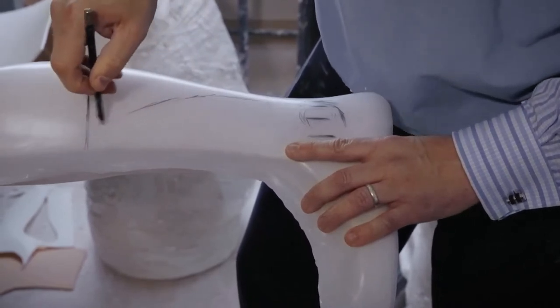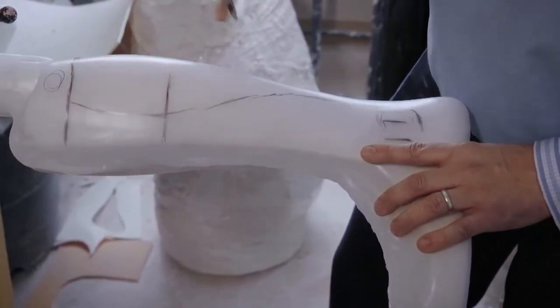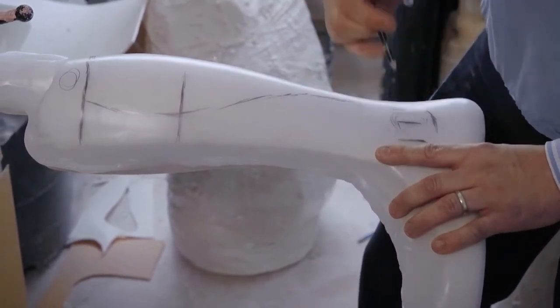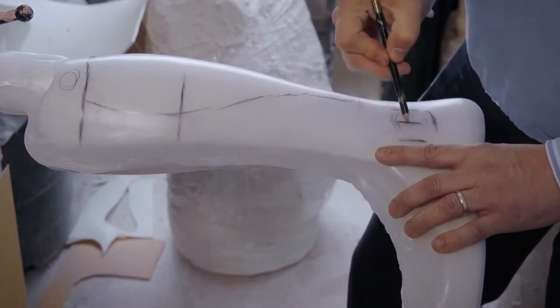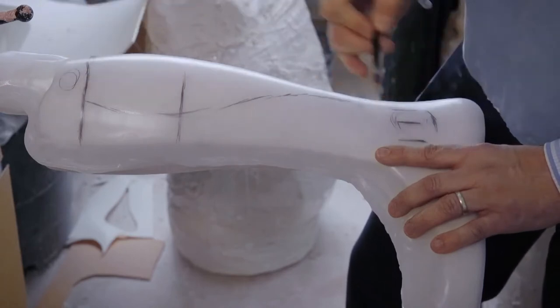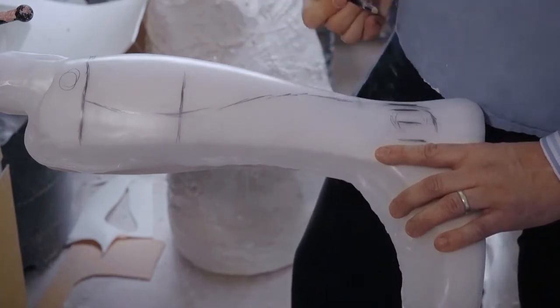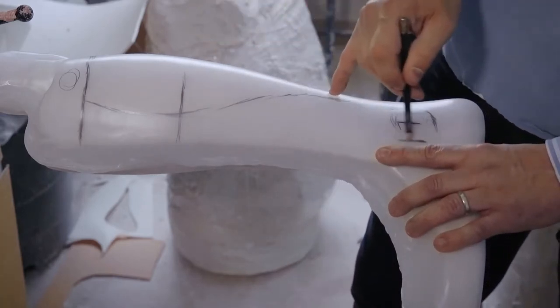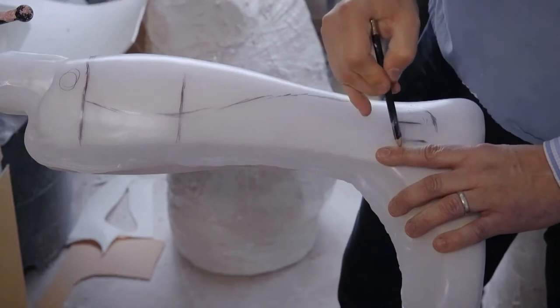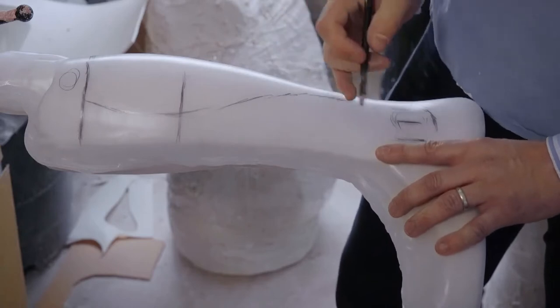A flexible AFO is for someone that has basically foot drop. If someone's knee is more involved, what we try to do is get more involved at the ankle because the two are connected via bones and ligaments. So if someone's knee buckles when they walk or hyperextends, you may think to go with a solid AFO and have more effect on that knee in a good way. And you can always trim back to a flexible after the patient has what we call return on their function.